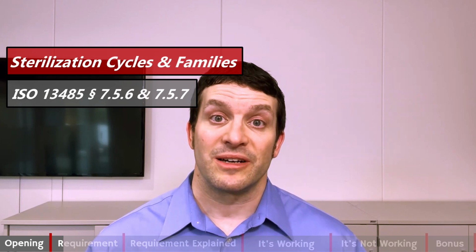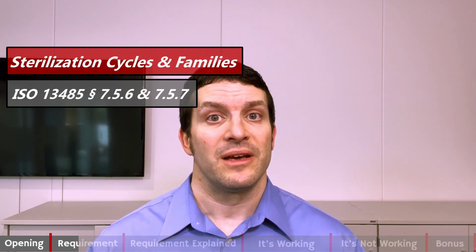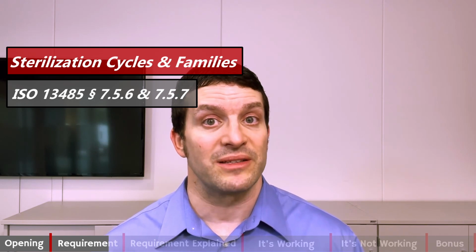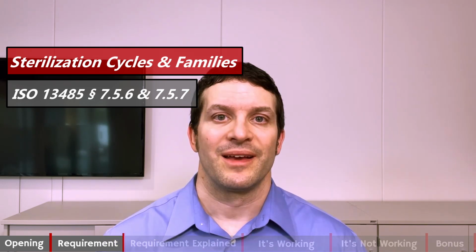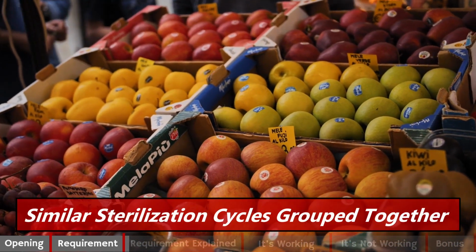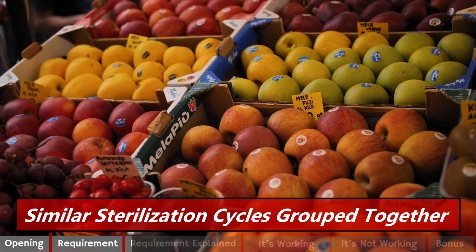Our topic, sterilization cycles and families, is covered by 13485, section 7.5.6 and 7.5.7. Sterilization cycles and families in 5 words: Similar sterilization cycles grouped together.